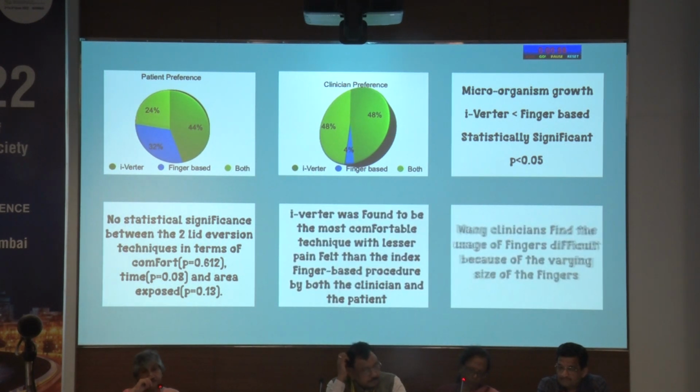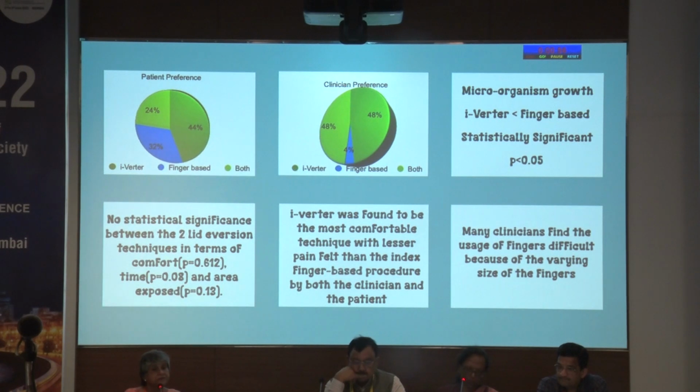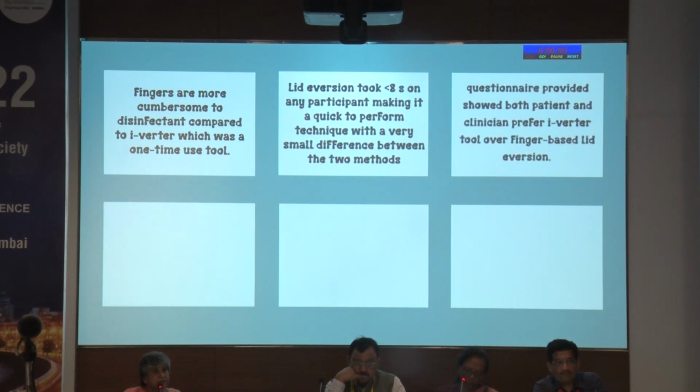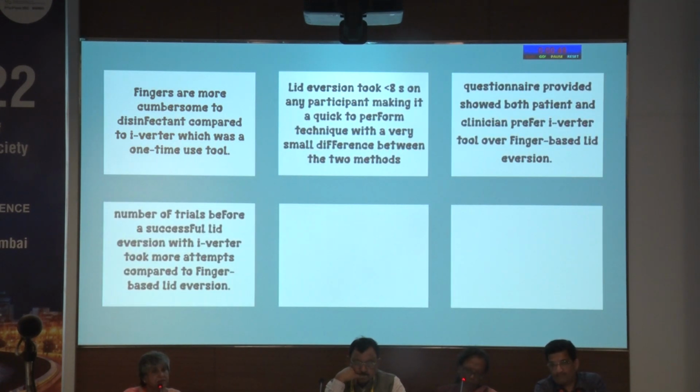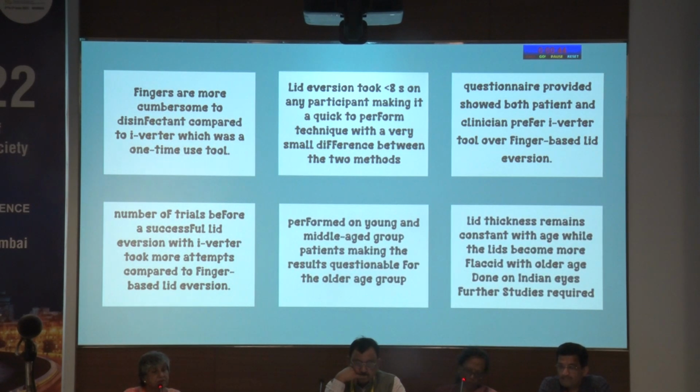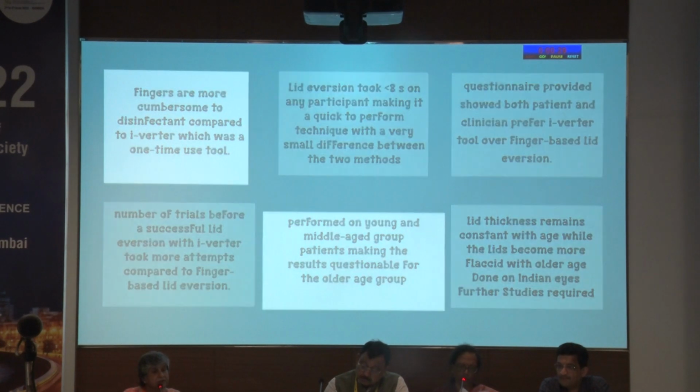The limitation with the finger was that every finger has a different thickness, so it becomes difficult to evert lids with the finger. Fingers are more cumbersome also because disinfection is more difficult. And lid eversion took less than 8 seconds with the help of iVerter. A questionnaire was also given and showed that iVerter was preferred. And the number of trials was more for lid eversion with iVerter, as seen in the questionnaire.